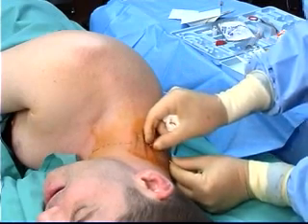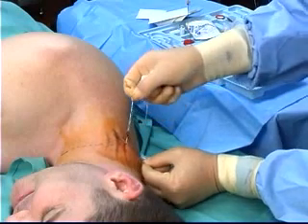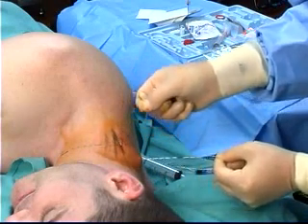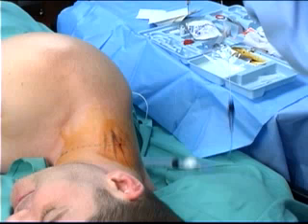The catheter is covered with a sterile transparent dressing and the snap lock snapped into the stat lock. Catheter removal, when the patient does not require the continuous nerve block any longer, and after full sensation has returned to the arm, is by fixating the proximal end of the catheter and then removing the distal end before removing the entire catheter.